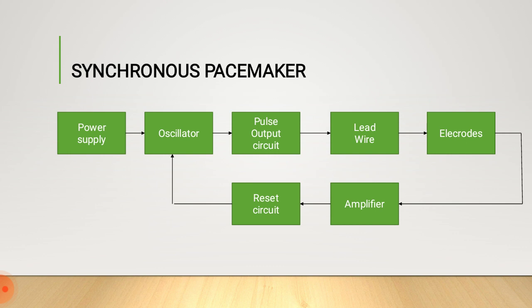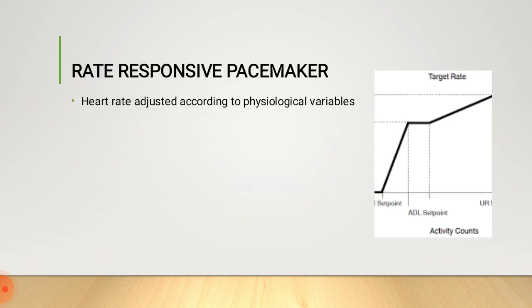Synchronous pacemaker. It triggers human heart contraction only when the normal beat is interrupted. While the human has a normal heartbeat, it doesn't generate the impulses. It can reset and generate the impulses if the human heart is in an abnormal condition.